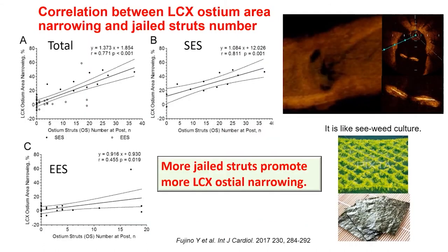This is a follow-up OCT study investigating the correlation between LCX ostium area narrowing and the jailing struts number. There is a positive correlation, which suggests that more jailing struts promote more LCX ostial narrowing.